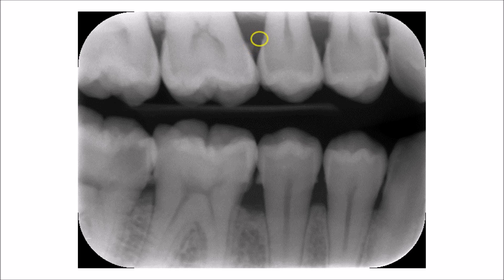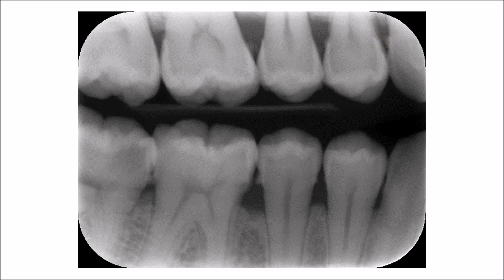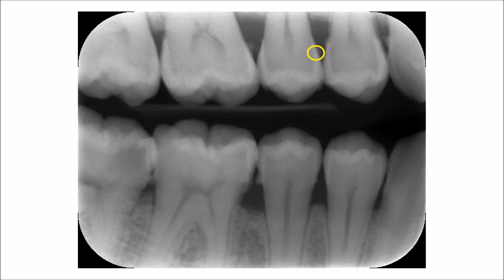Calculus can also be found on the distal surface of the first premolar and the distal surface of the canine. The calculus on the lower teeth has not been marked — please look and try to detect the presence of calculus on the different surfaces of the lower teeth. Also notice that whenever calculus is present, there is concurrent bone loss, along with the other factors that initiate and promote the periodontal disease process.